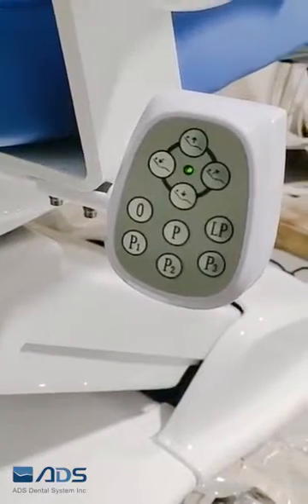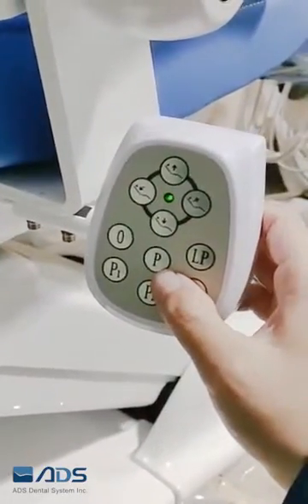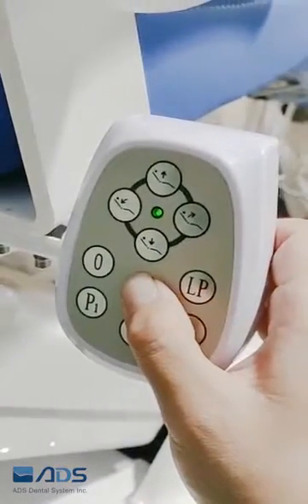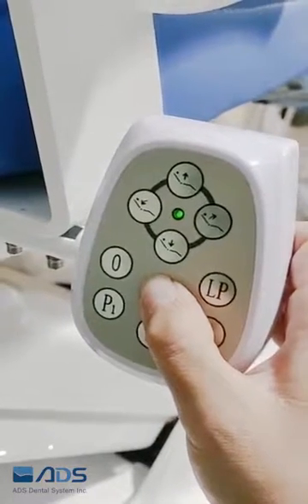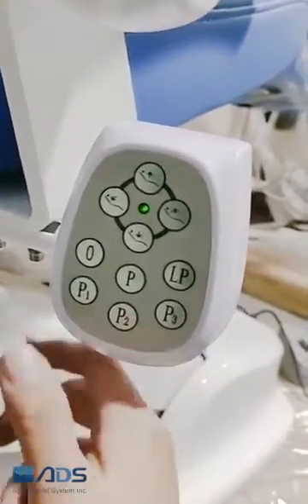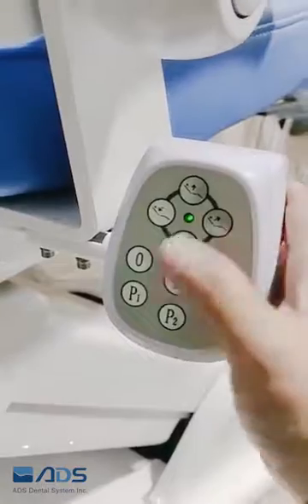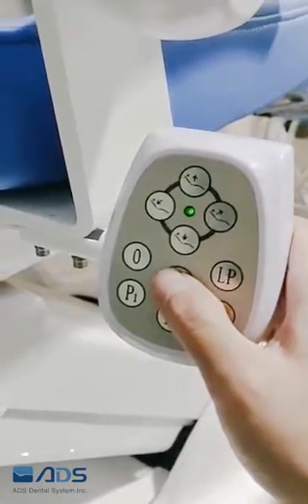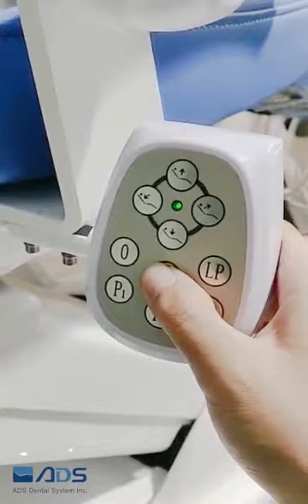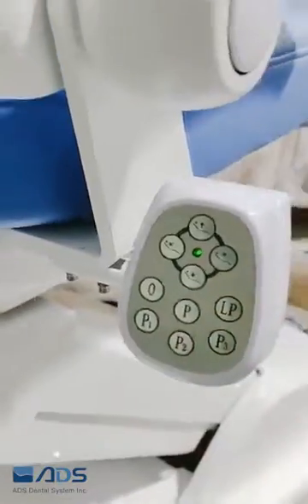Here is how to reset the chair position. First, press the P button for about 12 seconds until you hear two beeps, then press the P1 button. For the second step, press the P button again for about 12 seconds until you hear two beeps, then move the chair.